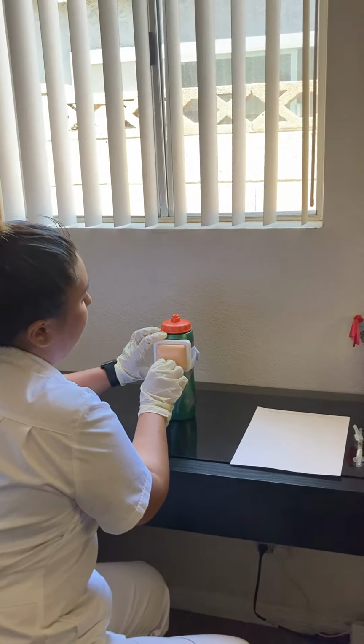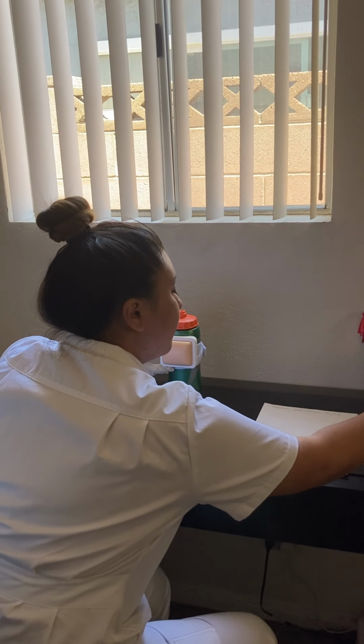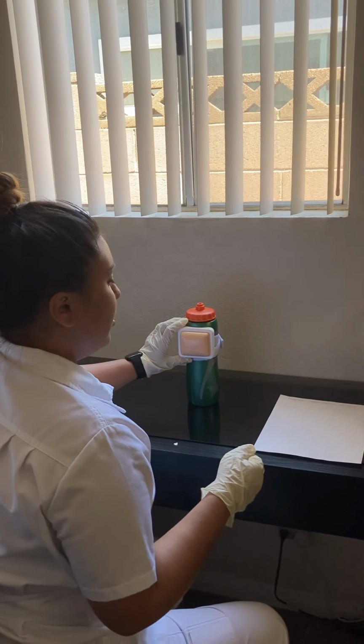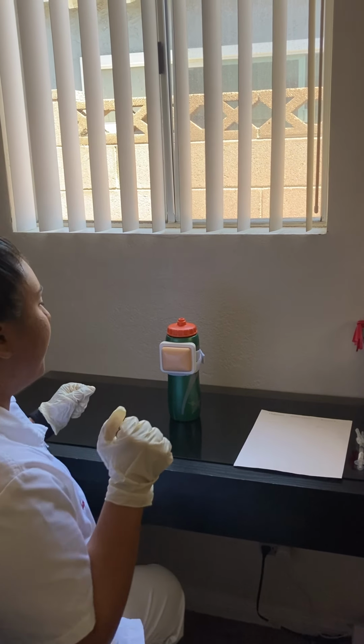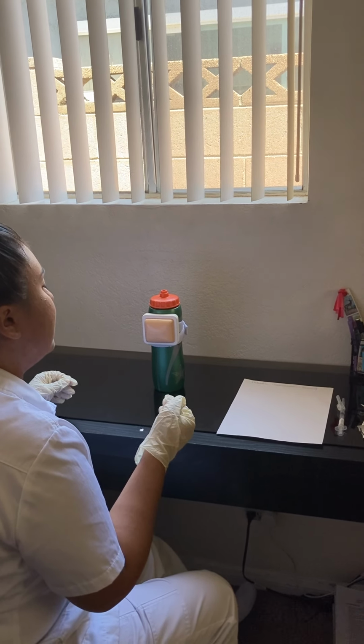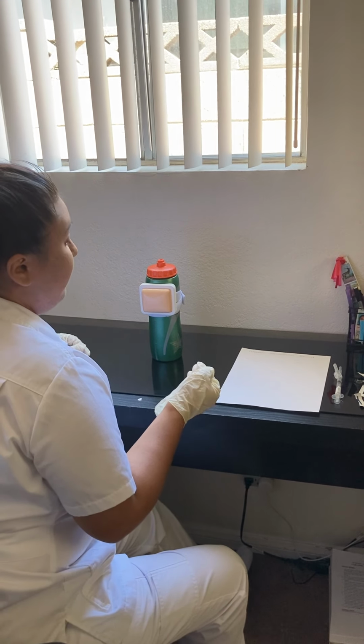I'm going to try to clean a good amount of area. Okay. I want to explain to the patient this vaccination will help your body create antibodies that will help protect you against the virus if you were to become infected.